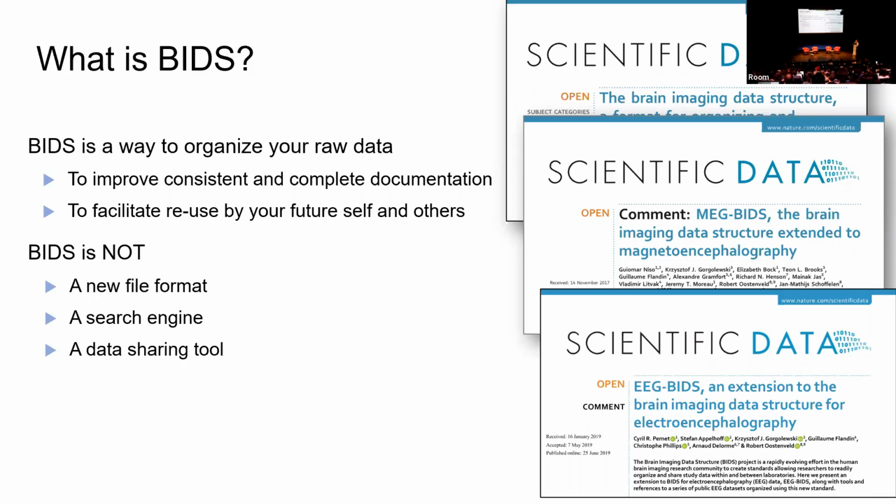And also currently there's a lot of effort to publish data online, to make it freely available. And for that, it's also really important to have a consistent and complete documentation of what was happening in your experiment and the information related to the data. BIDS is not a new file format or a search engine or a data sharing tool.